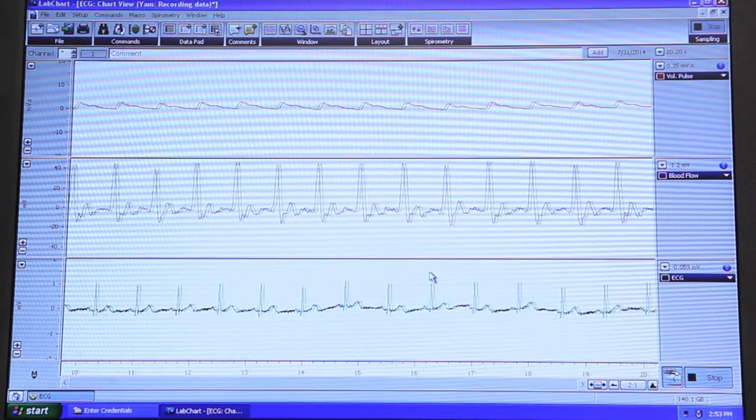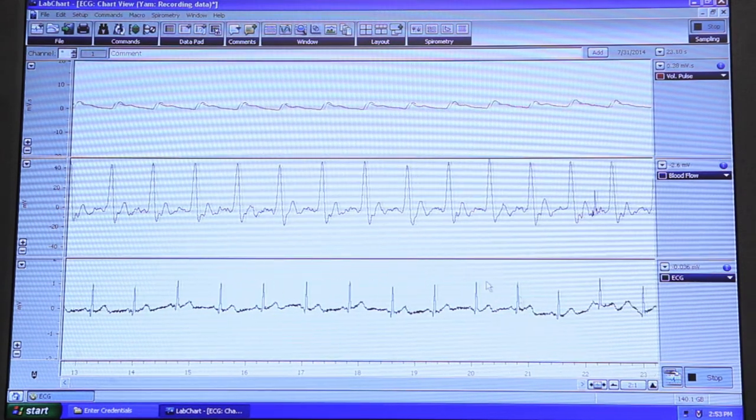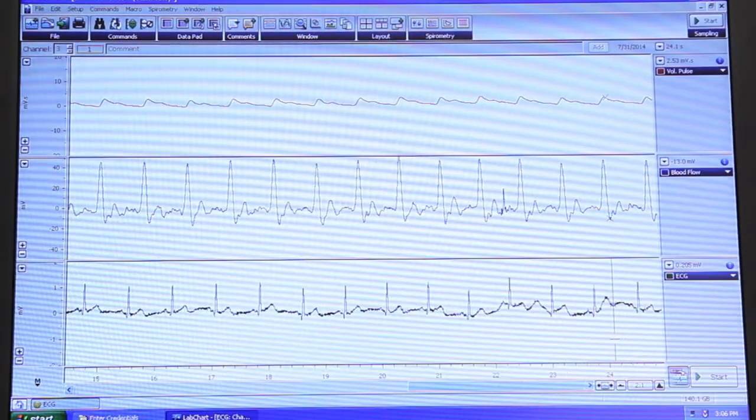When finished recording data, click the stop button in the bottom right hand corner of the screen. You only need about 20 seconds of a good recording.